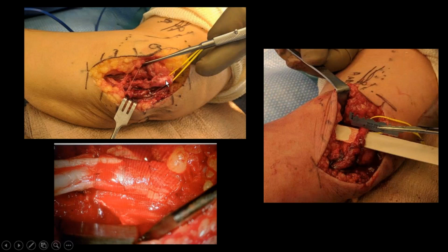You can see the neuroma. The nerve looks very disorganized. It's focally thick, and there is dense scarring in the area, which is cleaned to a certain extent in these two pictures. And after the nerve was repaired, you can see the nice looking nerve in this view, and there's a wrap around the nerve. Here the nerve has been cleaned, and it was repaired with the allograft in this area.